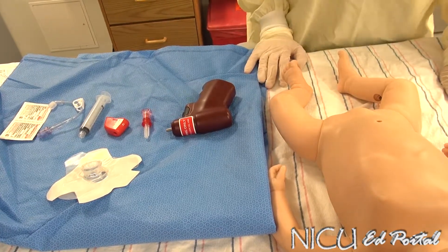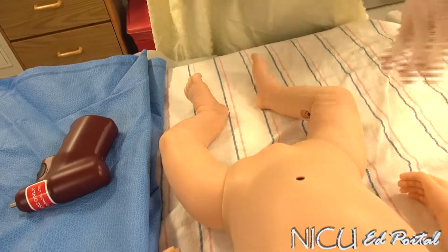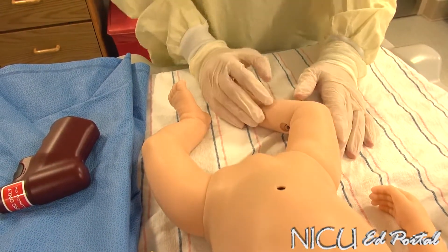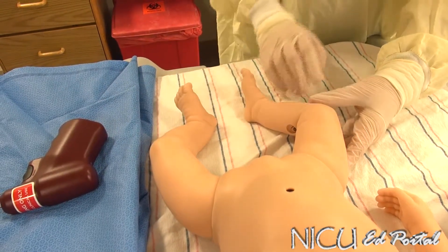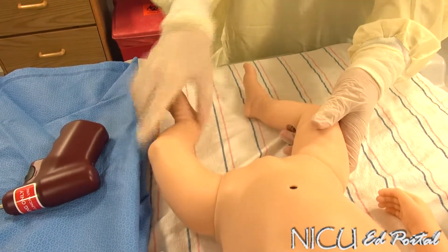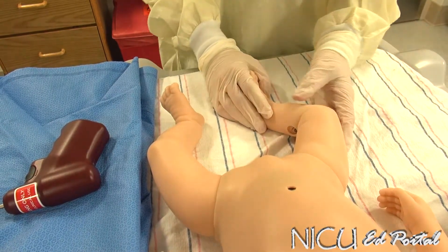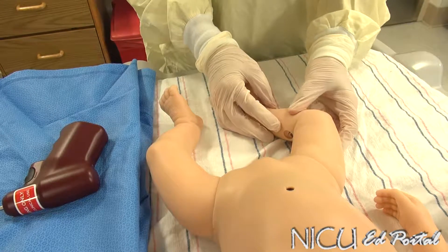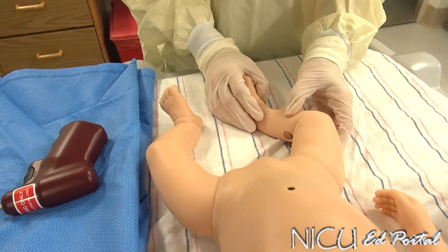To start with the procedure, we first do a timeout. We position the baby and identify our anatomy. We are going to do a tibial intraosseous line. The baby is well positioned. I'm going to identify the flat area, about 2 to 3 centimeters below the tuberosity, which should be right about here.